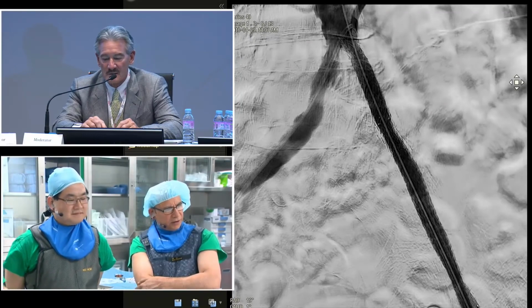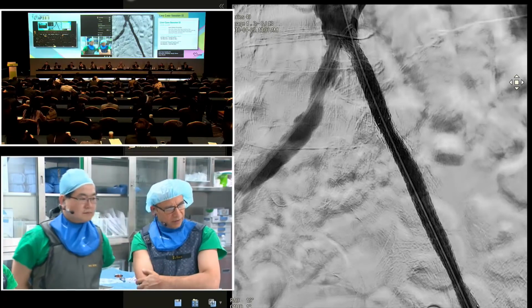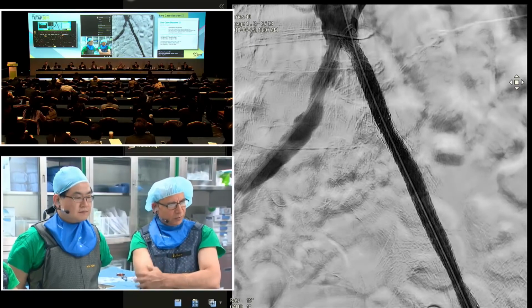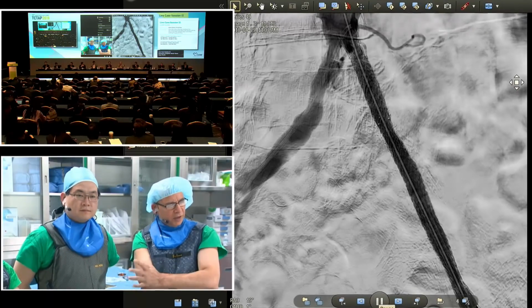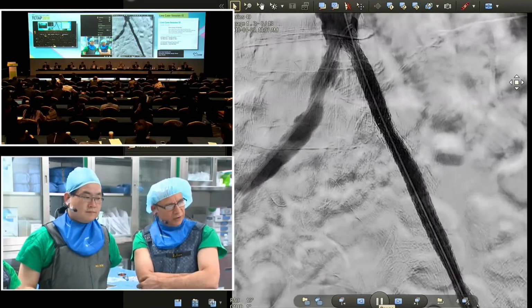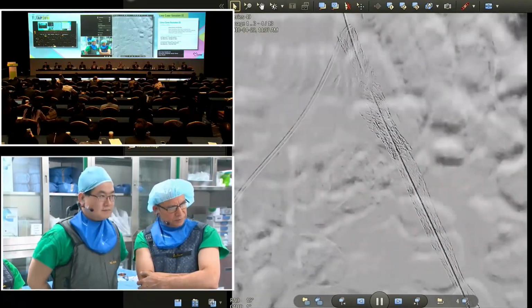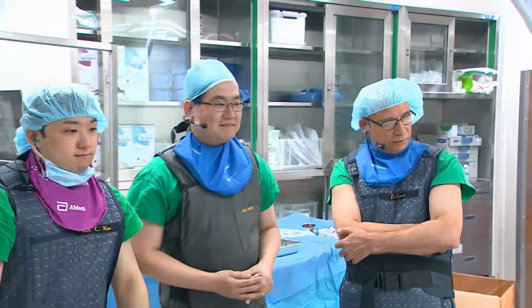Yeah, in the proximal external iliac, the stent that's there is an 8 millimeter previous stent, and the stent that was used is a similar size stent. So I'm not surprised it looks like it's actually inside the lumen of the previous stent, suggesting that it's not fully expanded. But that's a self-expanding stent, whereas the proximal stent is a balloon expandable stent. Yeah, it's a great result. I think you're to be congratulated for that. What the correlation is between MLD and patency of covered stents, we just don't know. Covered stents just don't behave the same way, but excellent outcome, and thank you very much.